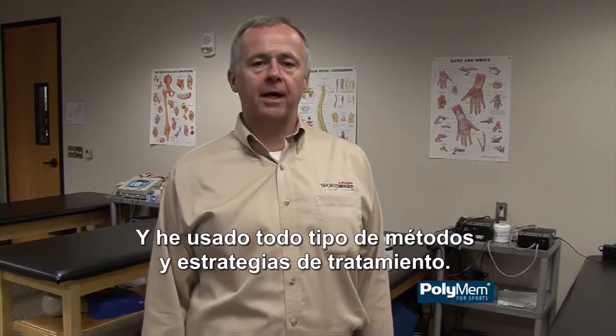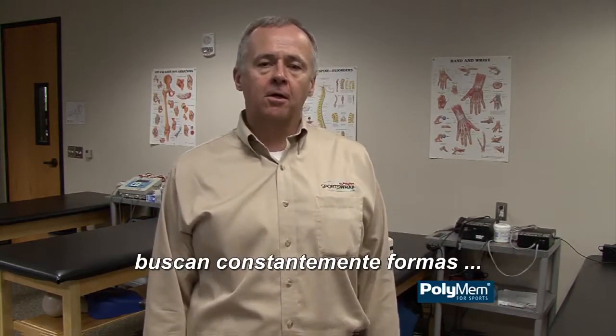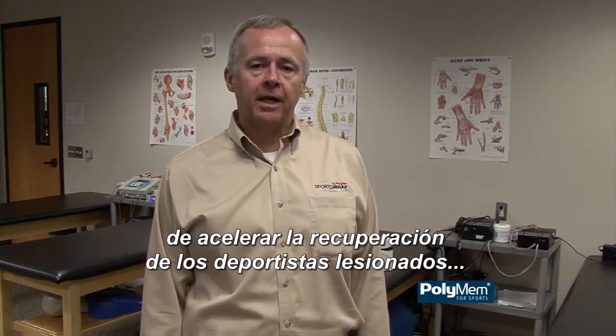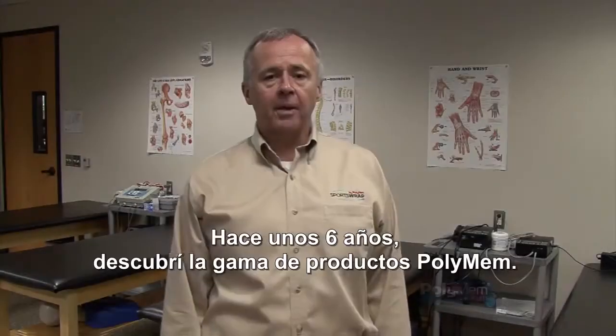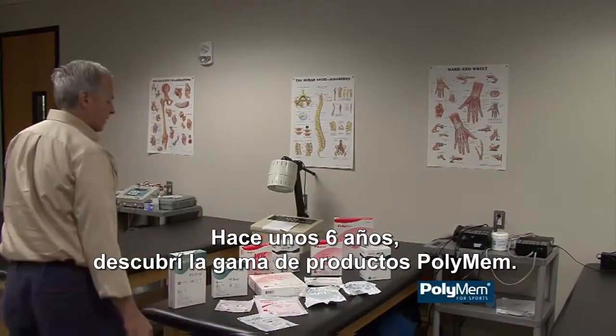I've used all sorts of modalities and treatment strategies. Athletic trainers like me are constantly seeking ways to accelerate healing of an injured athlete, to reduce pain, swelling, and inflammation. About six years ago, I came across the PolyMem family of products.